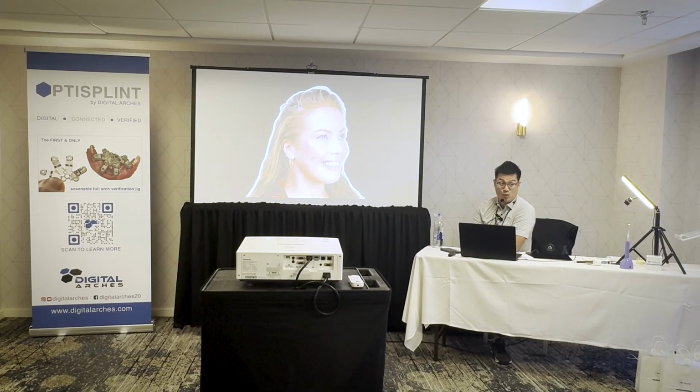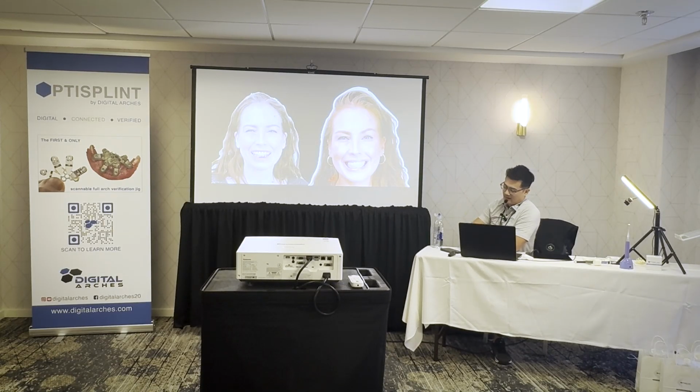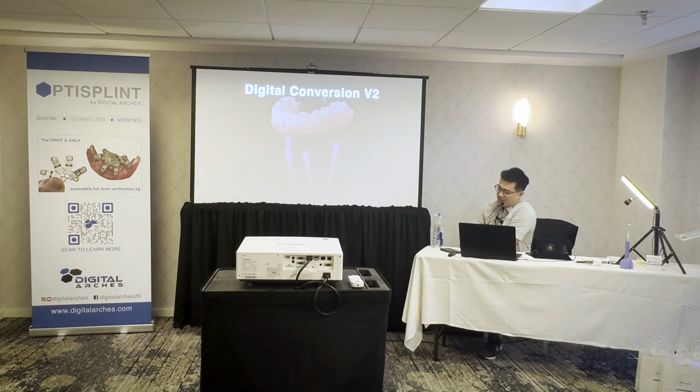I mean, that's a totally different person, right? I mean, that's pretty amazing. And the bite, this is nice. The bar was set pretty low because she had pretty bad, her teeth were bombed out, right? So if we did something a little bit, it's going to make it look way better. But the thing that really impressed me was that the bite required no adjustment, which for a case like this, I tell them, hey, be prepared to reduce 2 or 3 millimeters in the posterior teeth because you can have an anterior open bite because they drop back into CR, but no adjustment, which was okay, this works. And so this is what I'm doing now.